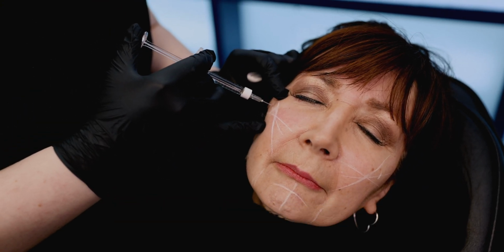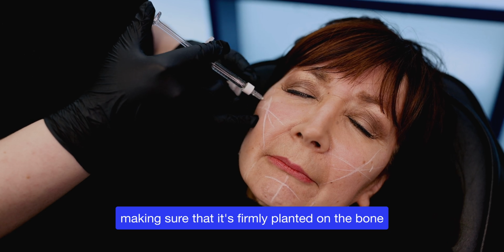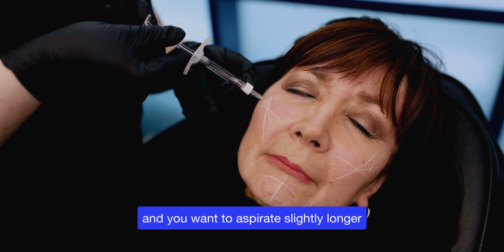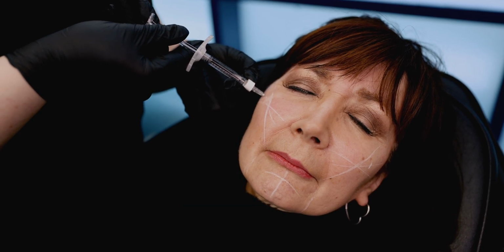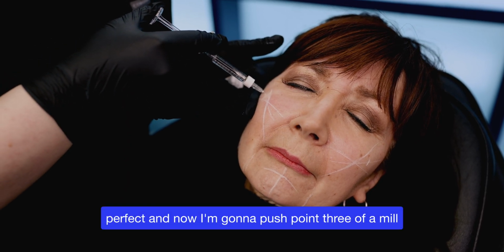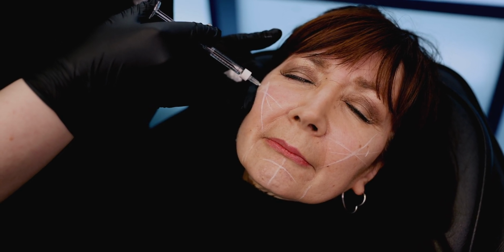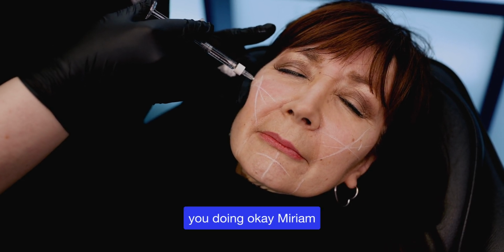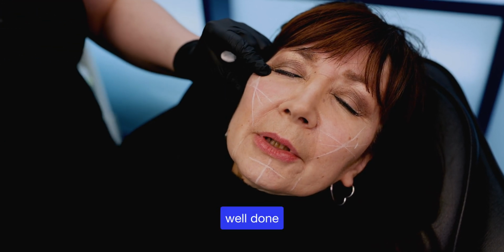Sharp scratch, Miriam. Making sure that it's firmly planted on the bone. I'm going to aspirate. And you want to aspirate slightly longer for deeper injections than you would for your lips or any other intradermal. Perfect. And now I'm going to push 0.3 of a mil. You doing okay, Miriam? Good stuff. Well done. Yeah, good.